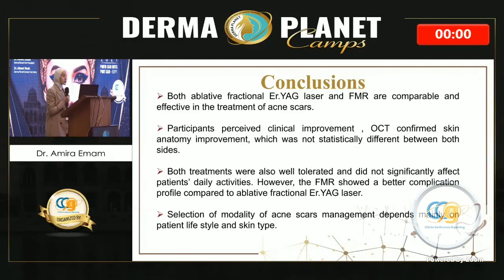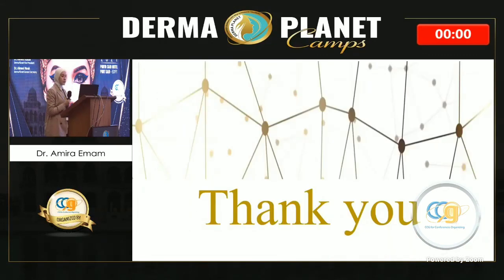We came to the conclusion that both ablative laser and fractional microneedling radiofrequency are effective in acne scar treatment. OCT confirmed the skin anatomy improvement, which wasn't statistically different between both sides. Both treatments are well tolerated. However, fractional microneedling radiofrequency has a better safety profile and more rapid return to lifestyle activities. Selection of modality of acne scar management depends mainly on patient lifestyle and skin type. Thank you.